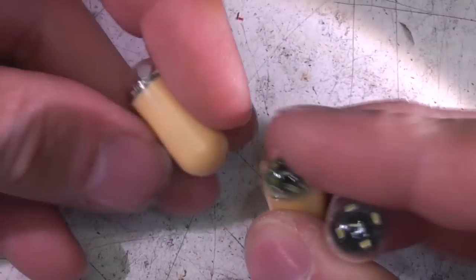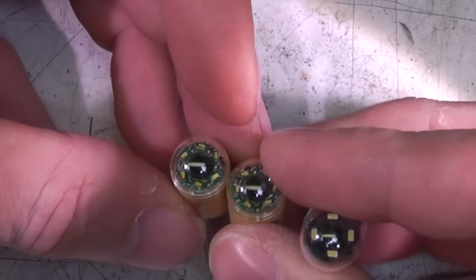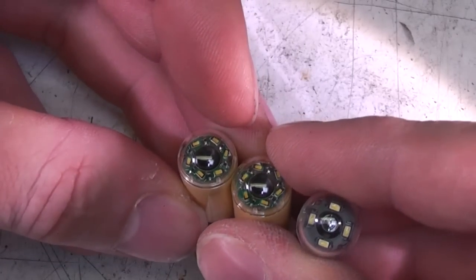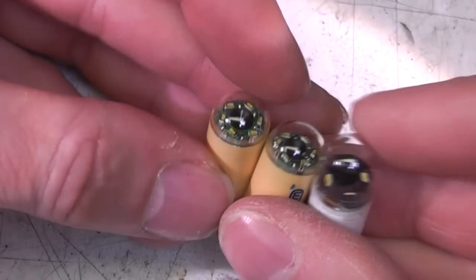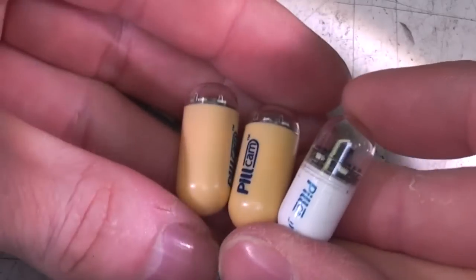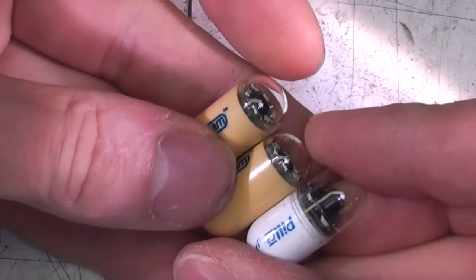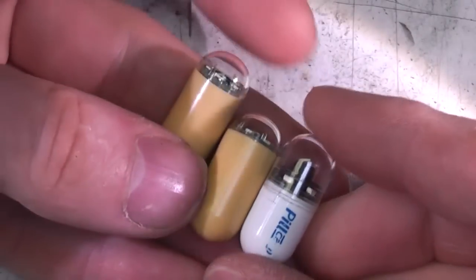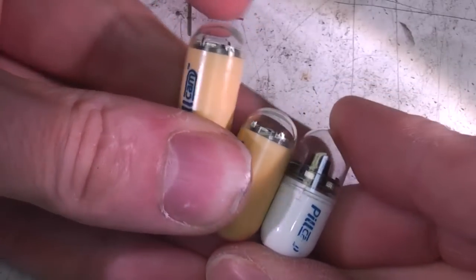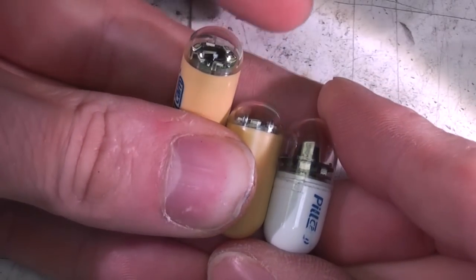Subsequent to my last pill cam teardown, courtesy of a gastroenterologist who prefers to remain anonymous, I've got hold of a few more pill cameras. These are the radio type made by a company called Given in Israel. There's two types here. I don't know whether these are actually different functional types or just different generations.